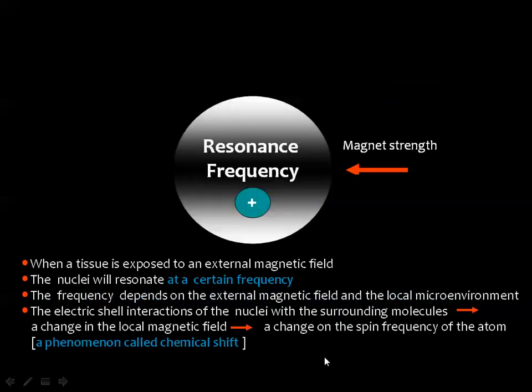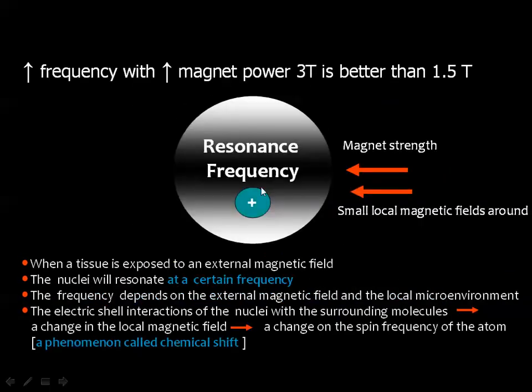Then if you have many proton groups and you apply an external magnetic field, this magnetic field will cause some disturbances in the resonance of the proton groups, enabling the MRI to separate them in a curve which can differentiate these proton groups even if they are very small and the magnetic field is also very small.